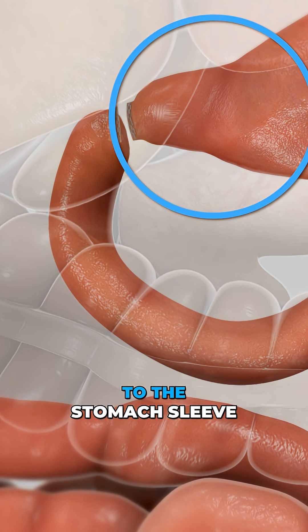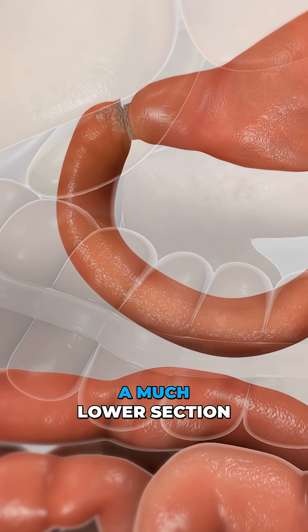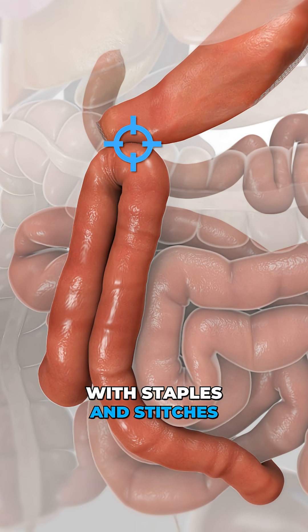On the limb attached to the stomach sleeve, the surgeon makes a small opening. A much lower section of intestine is brought up, a matching opening is created, and the two are connected with staples and stitches.